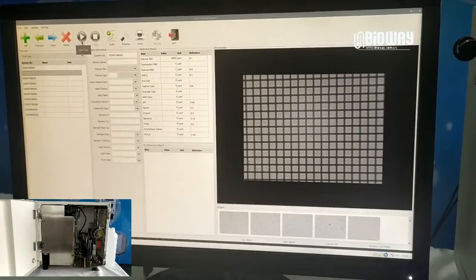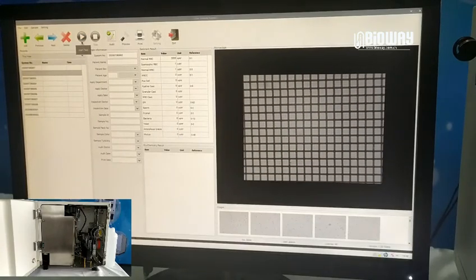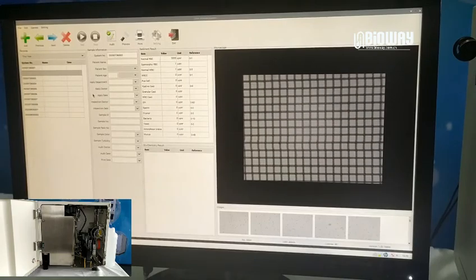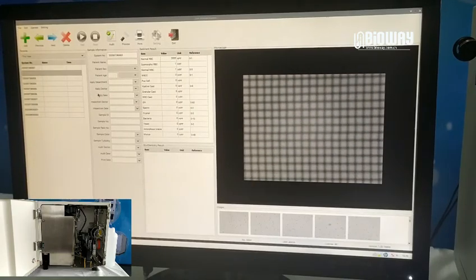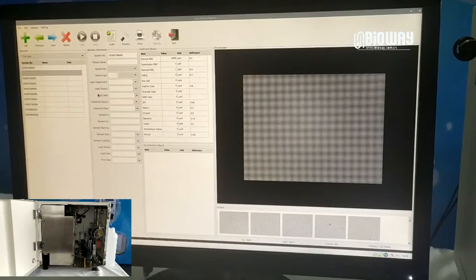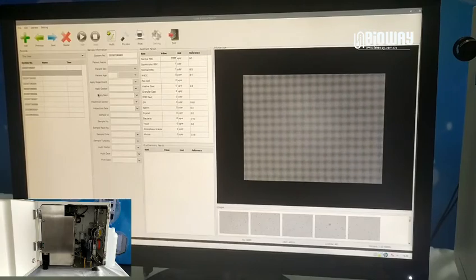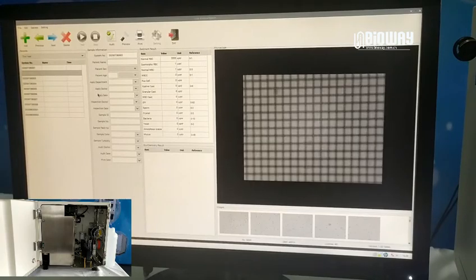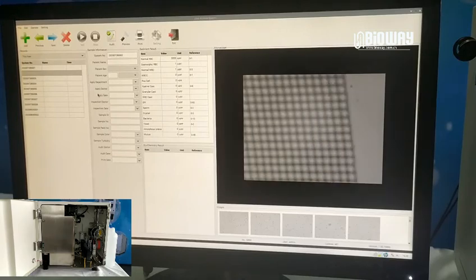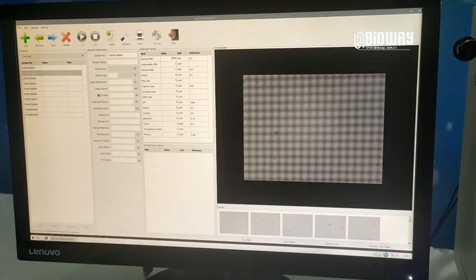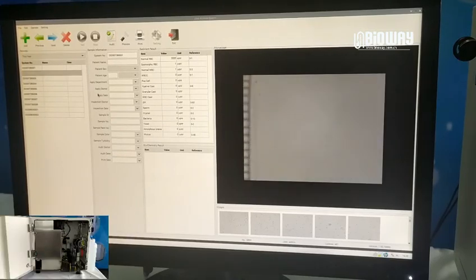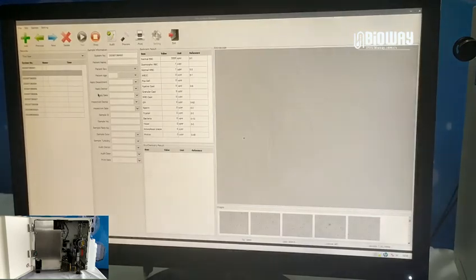The microscope will start focusing automatically. Each test takes around 2 minutes. During this period, BW2000 can automatically observe the urine sample, take images, flush the pipeline, and recognize the type and quantity of elements in the sample.